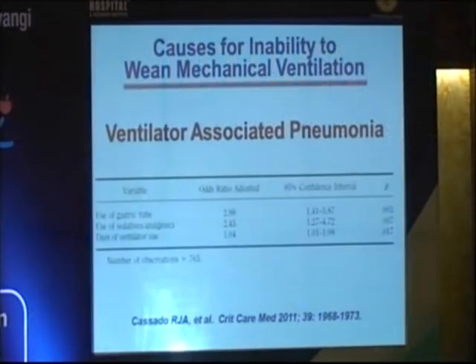Dr. Kratkin talked extensively this morning about ventilator-associated pneumonia, but certainly one of the things that needs to be thought about when a patient is recalcitrant to weaning is that they may have developed a ventilator-associated pneumonia. So if the pressures required to achieve a tidal volume are going up, the compliance is worsening. If the chest x-ray is looking worse, if secretions are now colored and excessive, this patient may have a ventilator-associated pneumonia, and you may have to step back, treat that pneumonia before you will be successful in terms of weaning.